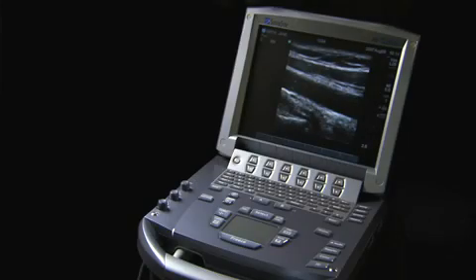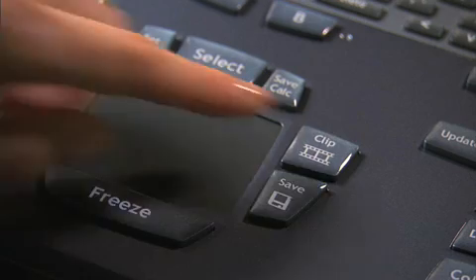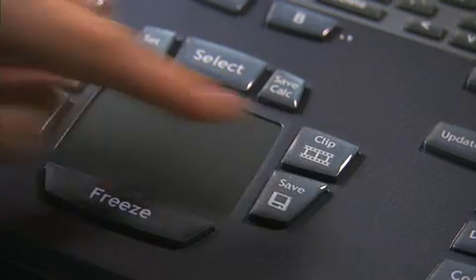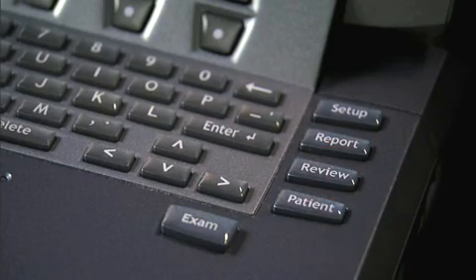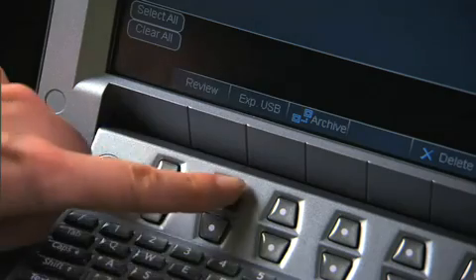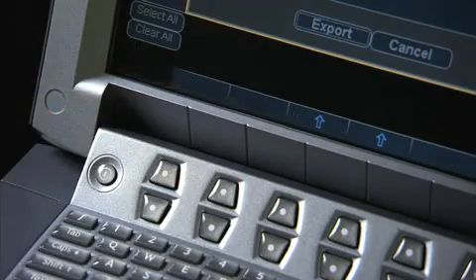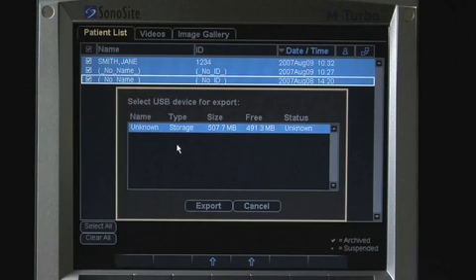This video will demonstrate how to save images and clips, recall these images for review, archive, or export images to a USB device.